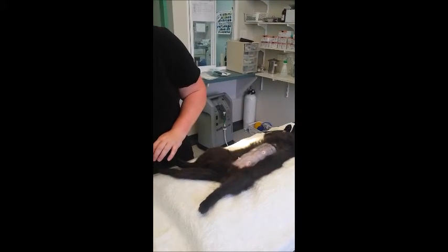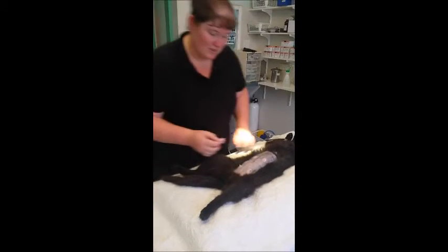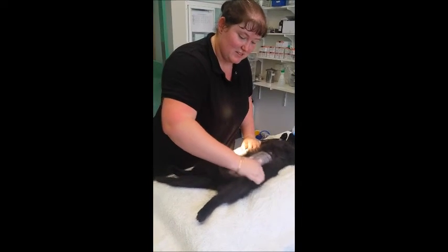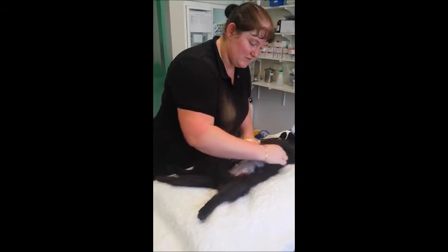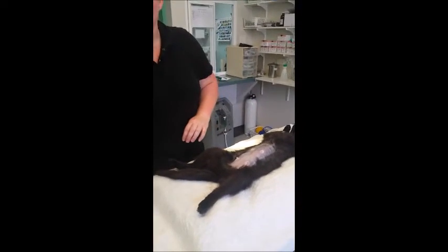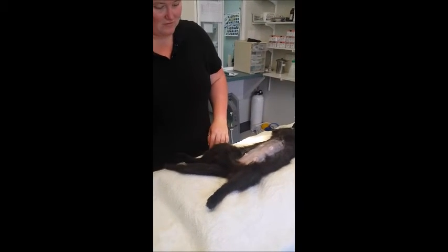Once I'm happy with the positioning, I will start with my scrubs. My initial scrub is a 10% Clorhex scrub with 90% water solution. I start by wetting the hair around the clipped area just to stop any hair getting into the surgical site.